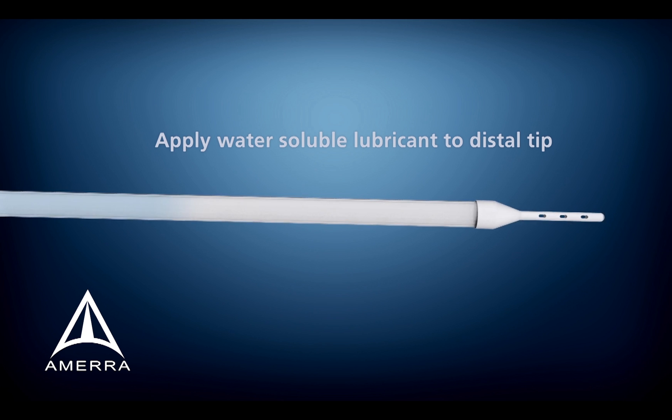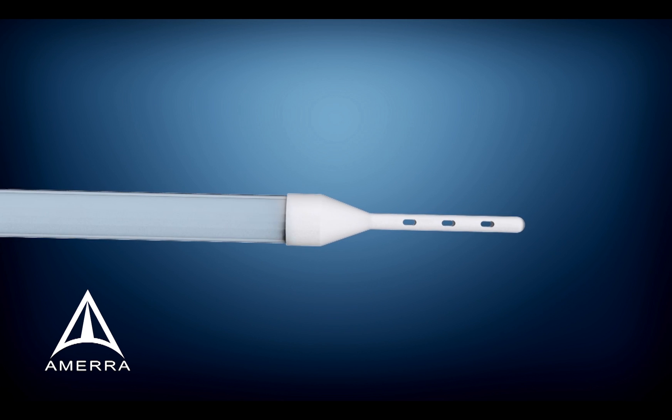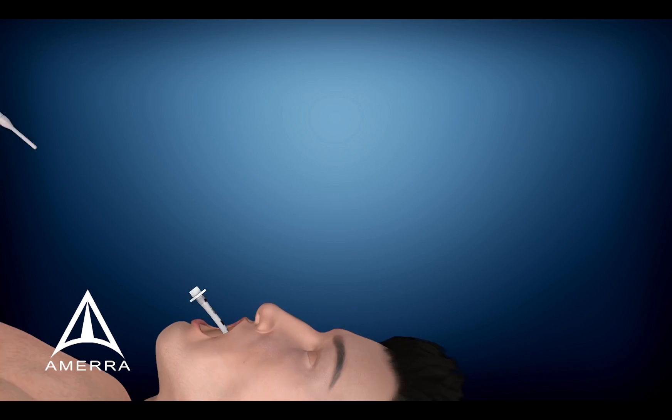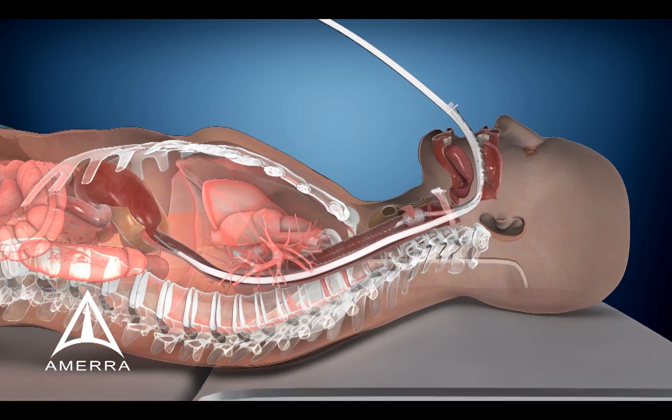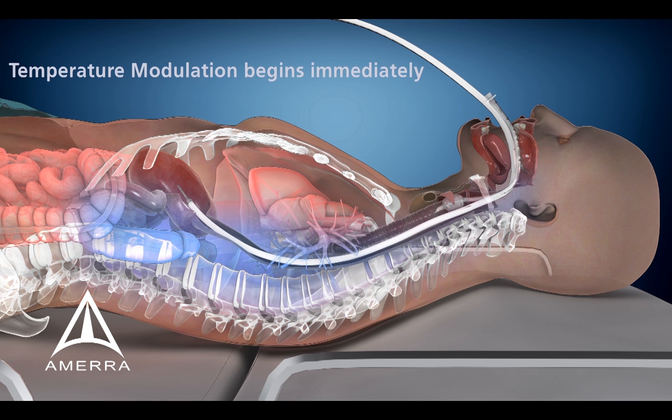After applying water-soluble lubricant to the distal tip, the clinician easily inserts the device into the patient's esophagus in the same manner as an orogastric tube. Cooling begins immediately.